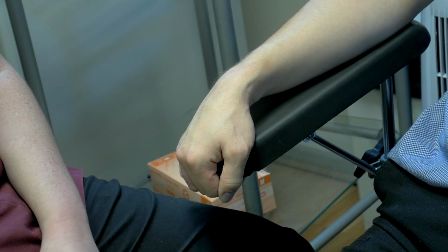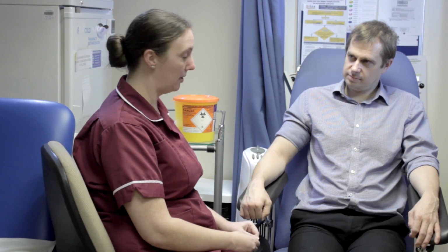Today I'm going to demonstrate how to take blood using a winged infusion set, otherwise known as a butterfly needle, from the hand. So the very first thing we do is wash our hands to clinical medical standards. That should be for a minimum of 30 seconds. If we're doing it properly, it really should be taking closer to a minute.